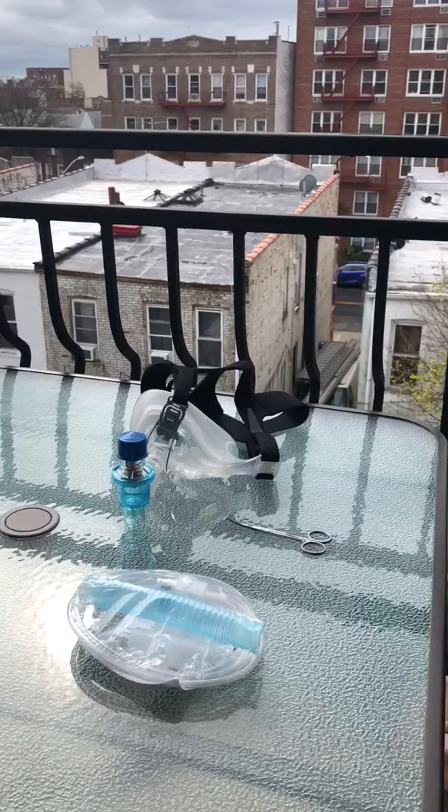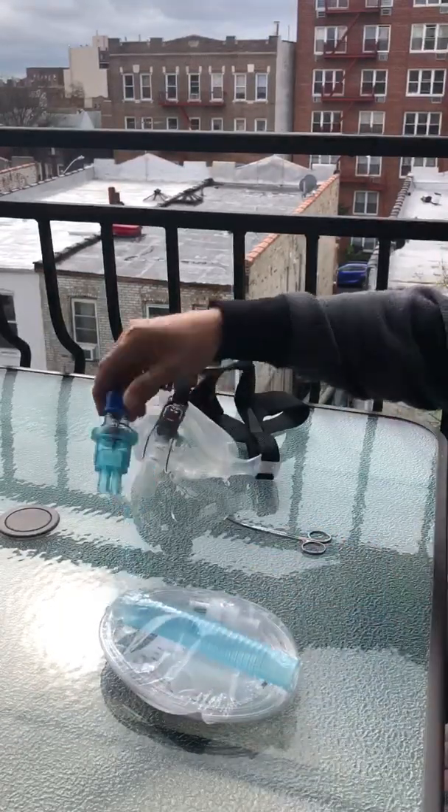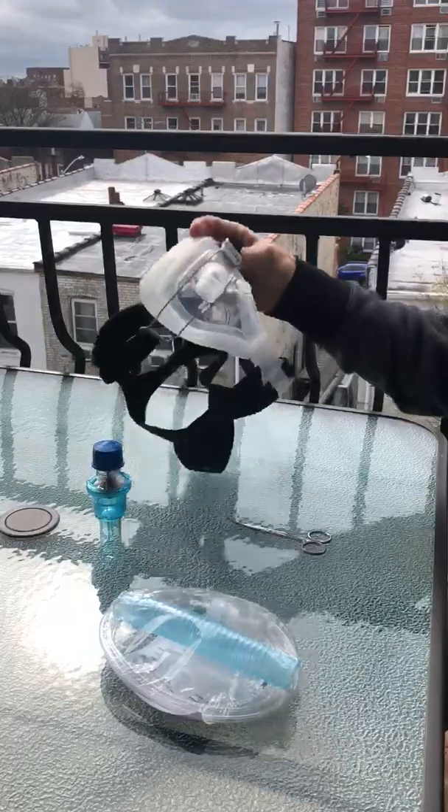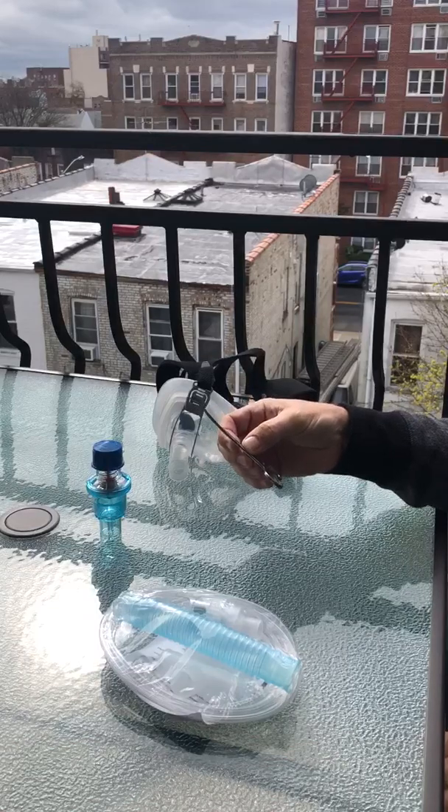Welcome to sunny Brooklyn where we're quarantined on my balcony. Today we're gonna talk about making a CPAP device out of common items that you'll find in your respiratory closet. We have a typical nebulizer, a PEEP valve, a CPAP mask, and scissors from a suture removal kit. Let's get started.